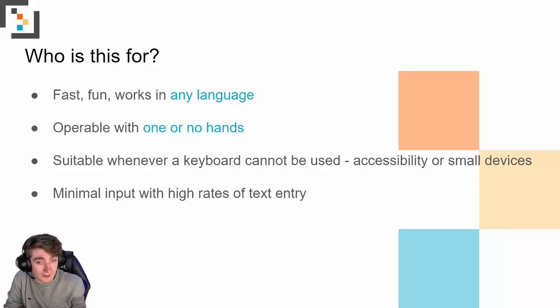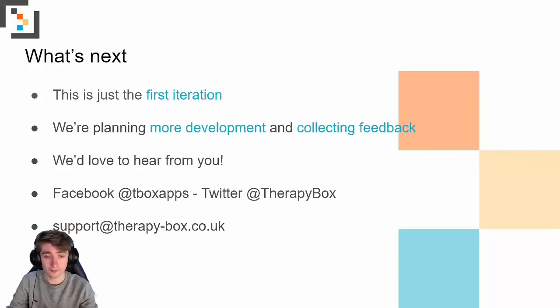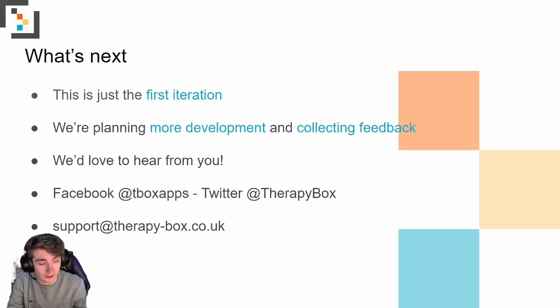The main benefit of Dasher is that you require minimal input, but you're still retaining those high rates of text entry. So, what's next for Dasher and Predictable? Well, this was just the first iteration. We're currently planning more development for it and collecting feedback on the current version.